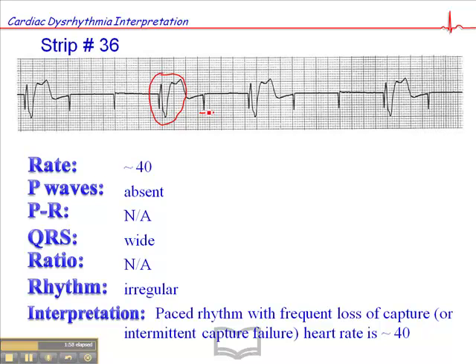Here we have loss of capture. If we don't see electrical capture, we're probably not going to feel mechanical capture, but we're going to check a pulse anyway. If you were to feel a pulse, it would probably be around 40. This is a serious problem — a pacemaker rhythm with loss of capture and bradycardia. It may be positional, so you may find that the patient has good capture when lying on one side and loss of capture on another. You might fiddle with that during transport. But this is a problem that can only be managed in hospital, where they may have to go in and make adjustments to the pacemaker.